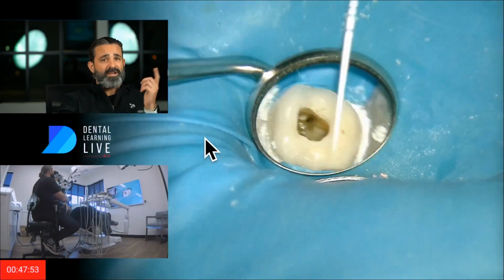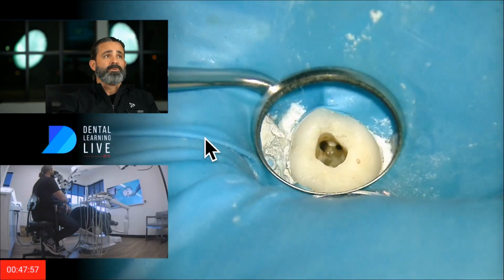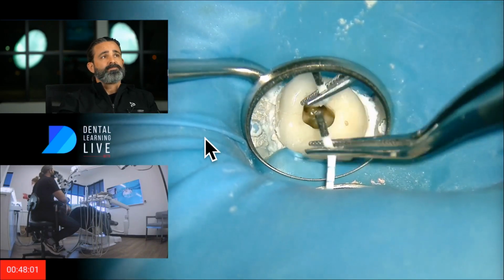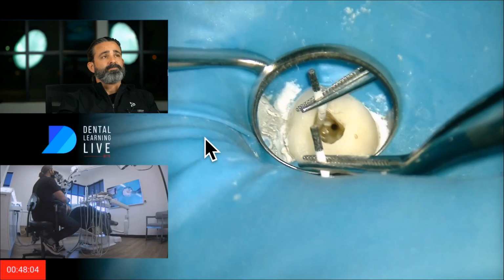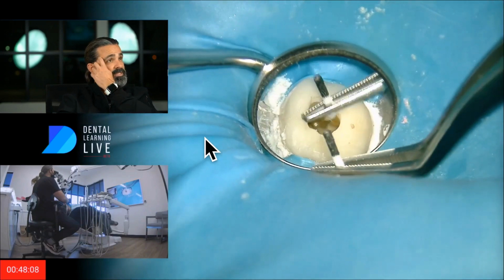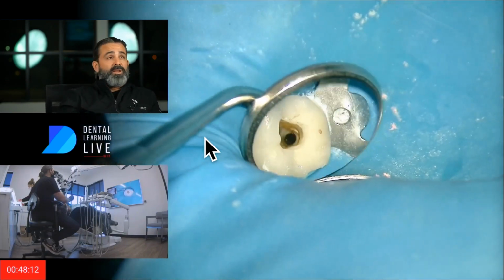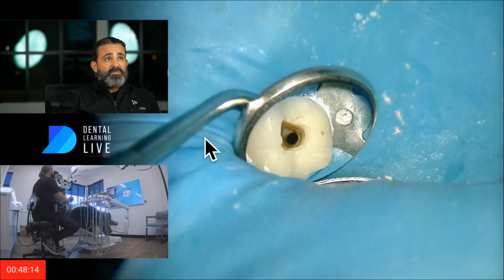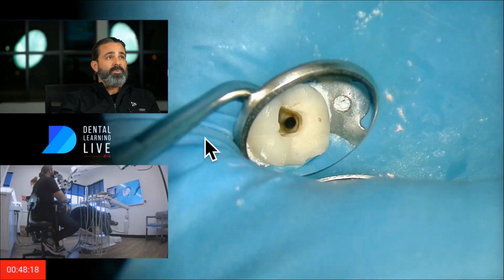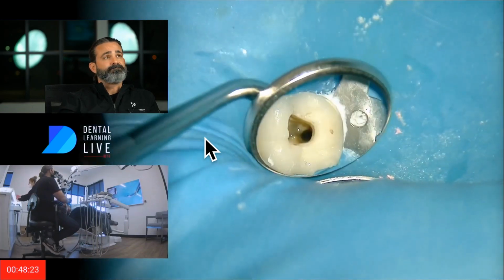I'm just drying this up as I was talking. Nothing crazy, just drying it up, wicking everything out. Getting to the end of that. Like I said, I'm really hyper on that MB1 and MB2 because I know that's the crux of my problem. But I'm looking at what's coming on these paper points through all of them. Want to keep them dry.